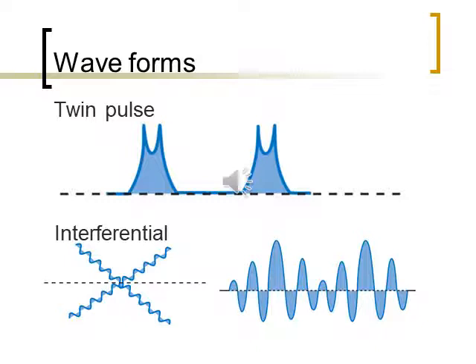There are some other proposed ways you can use high volt just beyond the basic sensory and neuromuscular stim, and we'll talk about that when we get to it. On the bottom, we have an interferential current. So interferential is kind of a unique current because it uses two channels. As I showed you, you cross the channels with the interferential, and it basically creates a constructive interference.